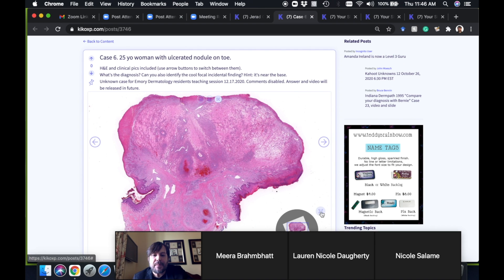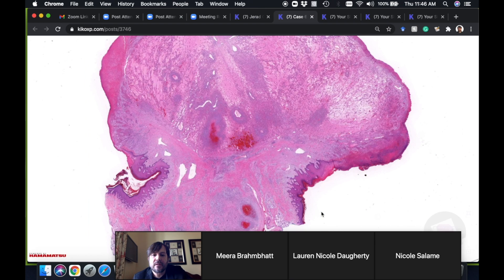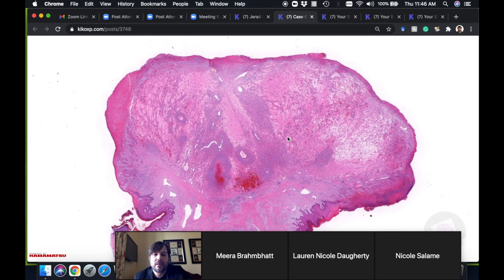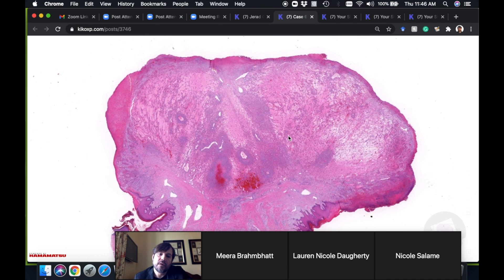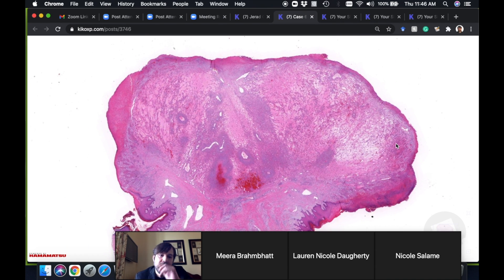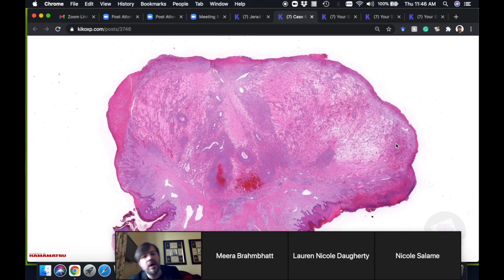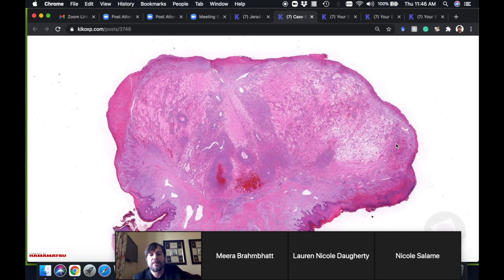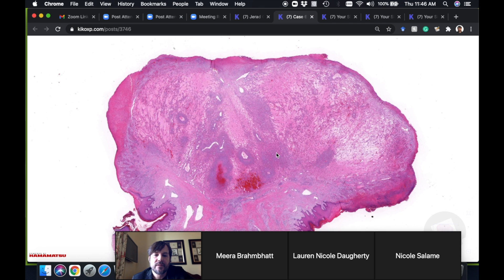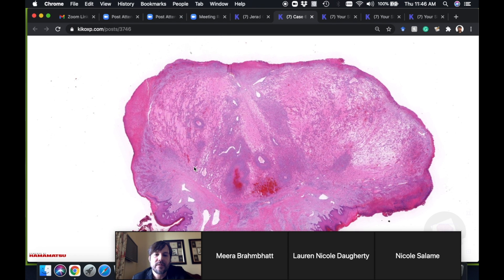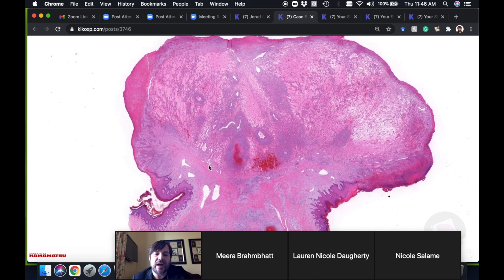And then here's the path. Let me hear from one of the junior derm residents—did any of you figure this out? I had two questions: one is what's the diagnosis, and number two is what's the bonus finding. Don't be shy.